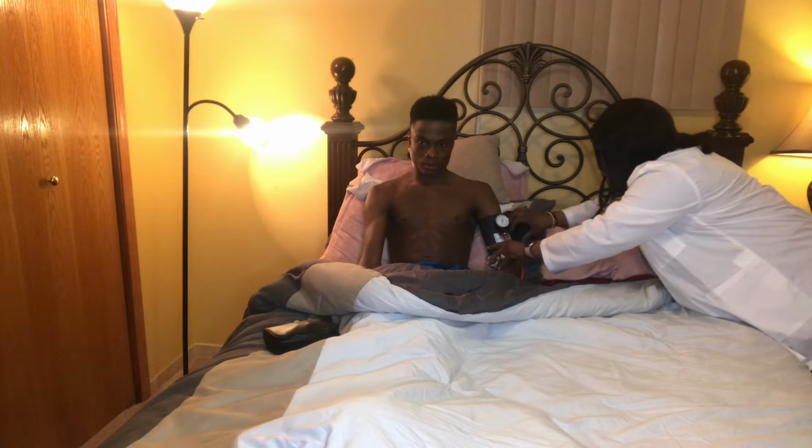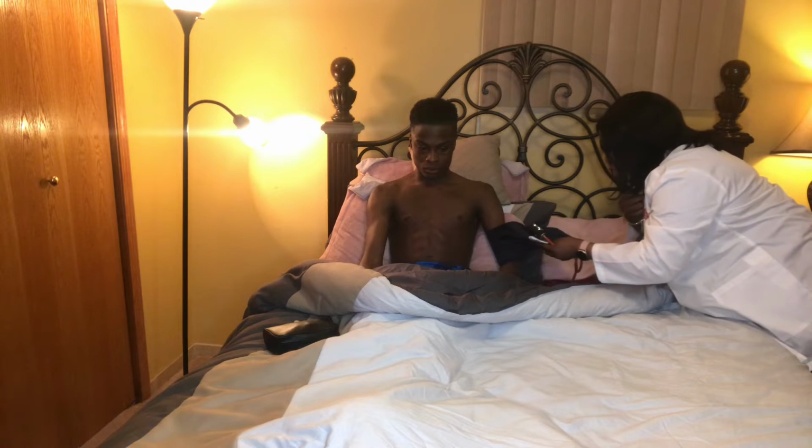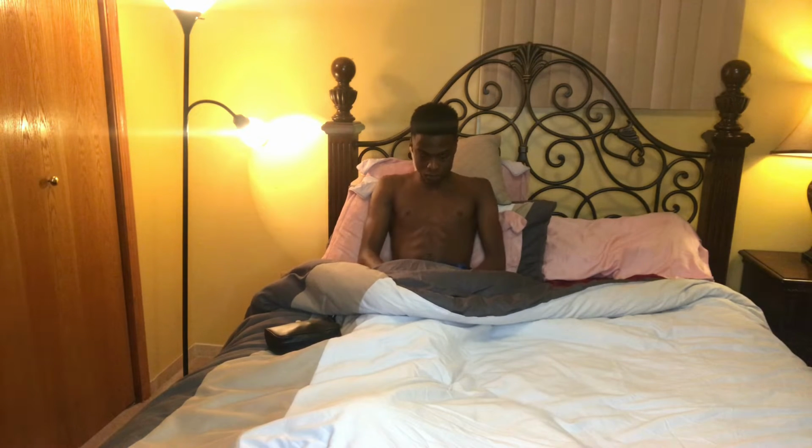Your blood pressure reading while sitting up on your left arm is 110/60, which is not much difference. It's a normal reading for you, okay?